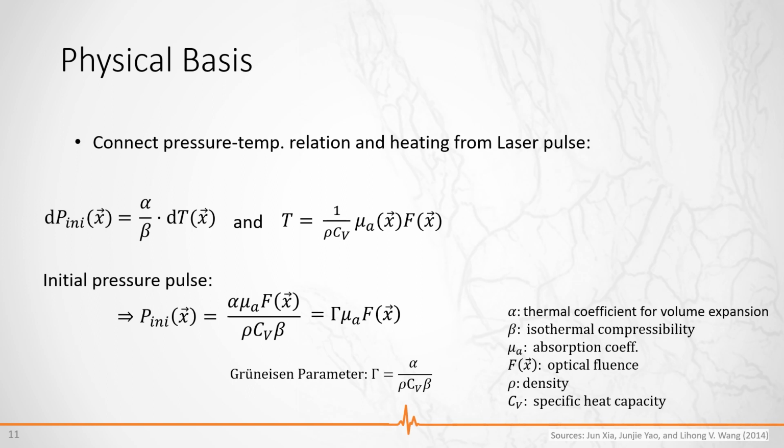efficiently. And we can see the big difference to optical only or ultrasonic only measurements again. The signal comes from absorption instead of reflection or transmission. Therefore, the contrast depends mainly on the difference between absorption coefficients of the target and the surrounding tissue. Now that we know that the absorption coefficient is the decisive factor for PAI, we can take a look which types of targets are detectable at what wavelengths.